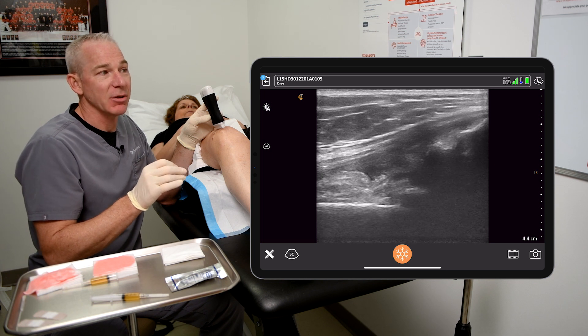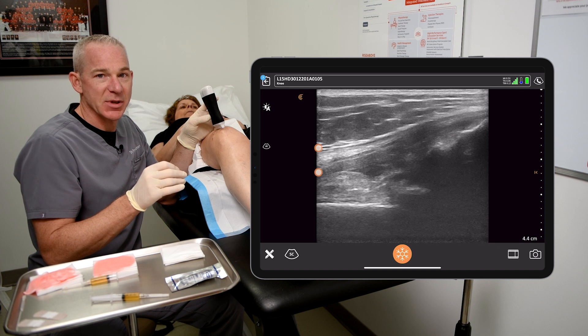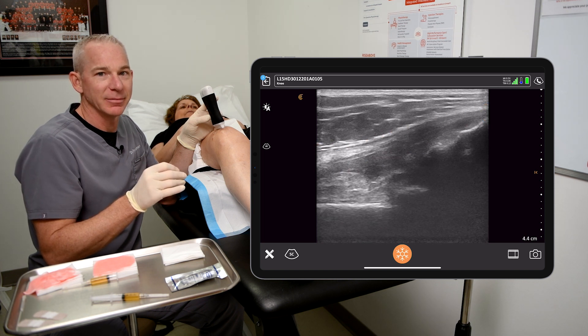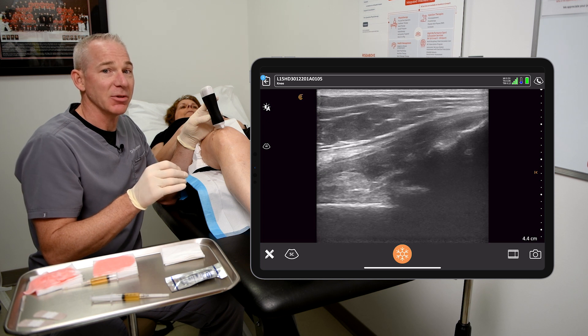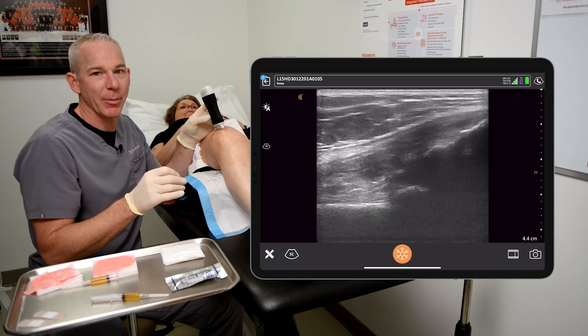What we see here on the right-hand side of the screen is the patella, the quadriceps tendon, and the suprapatellar fat pad. On the bottom left of the screen we see the femur and the pre-femoral fat pad.